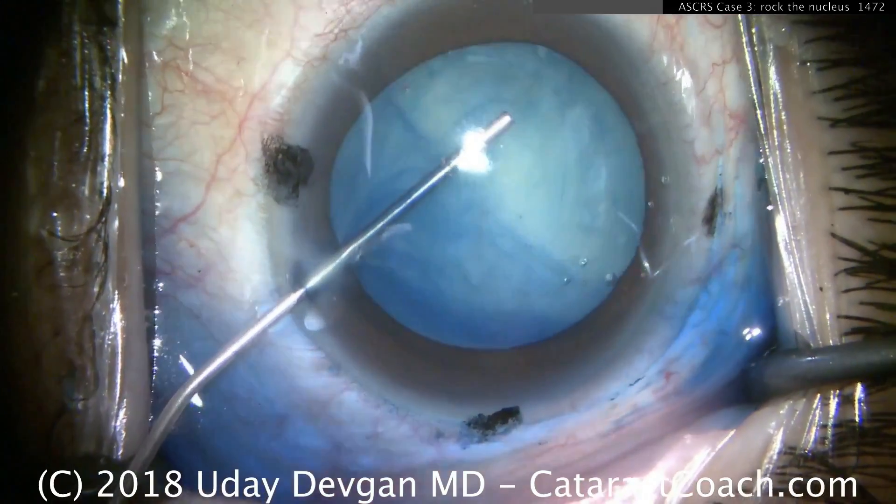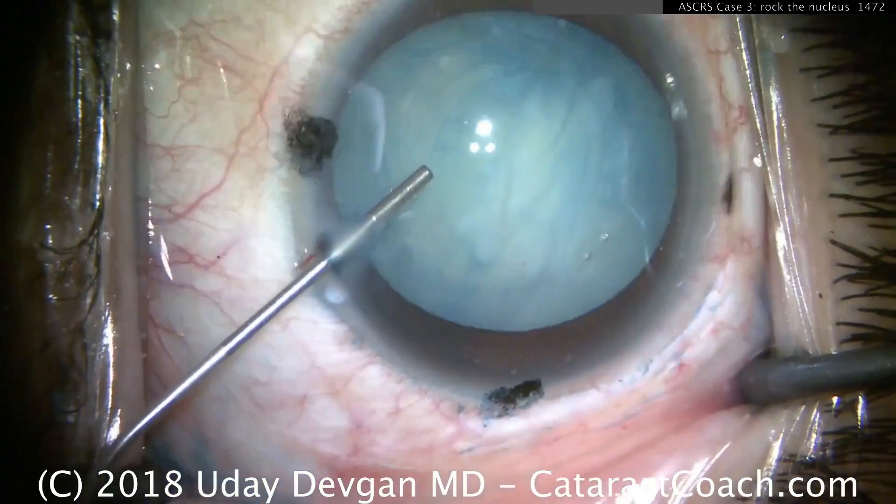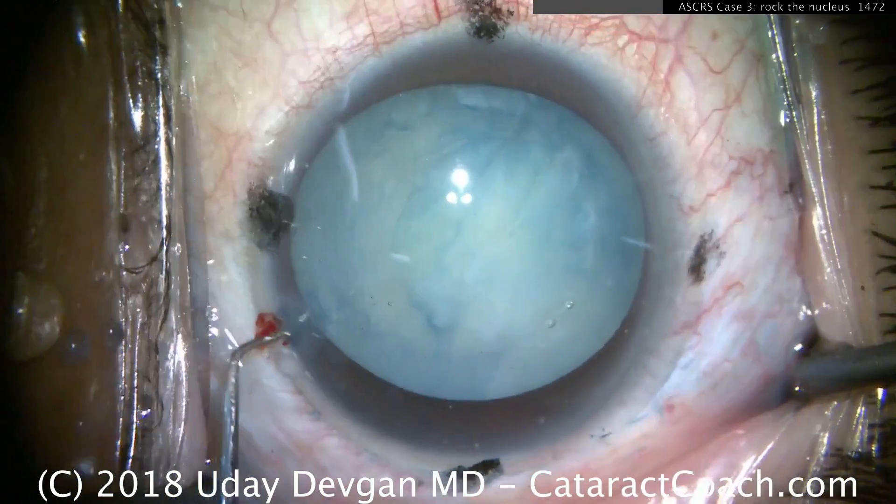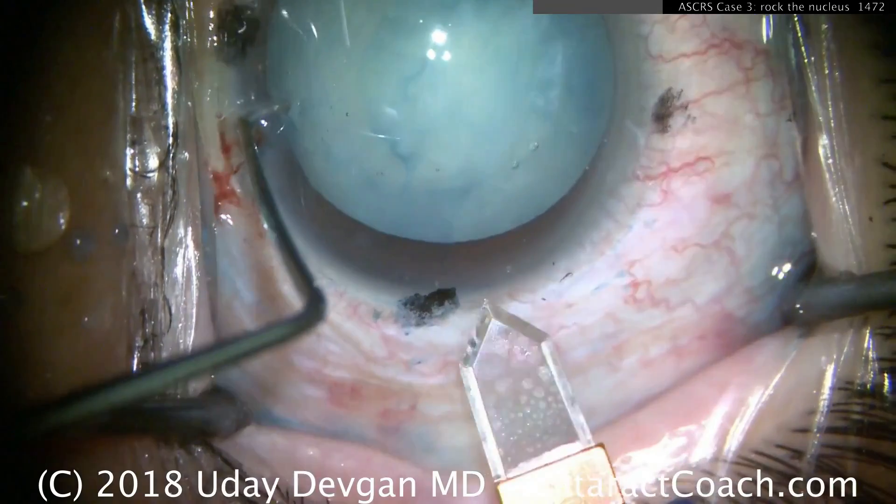There are a lot of techniques we can do here. Here's another one — the femtosecond laser. You may say femtosecond laser is better, right? No — look carefully. That lens capsule is still attached at a couple of points. So we'll make the main incision here with a diamond. Why a diamond even though I'm using a femtosecond? Because the diamond makes a nicer incision than the femtosecond laser.